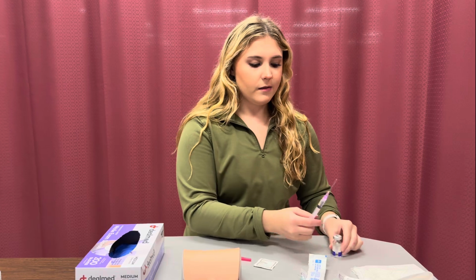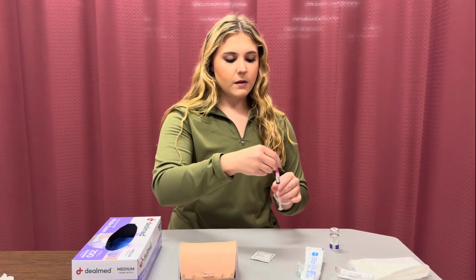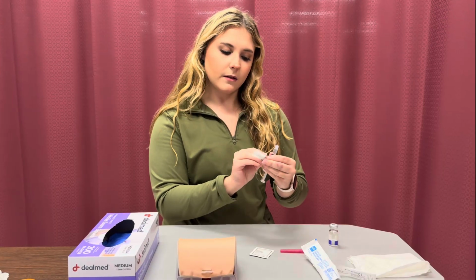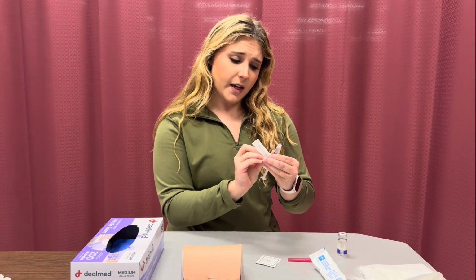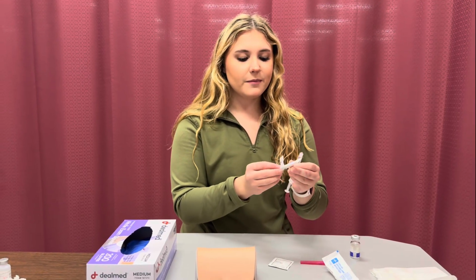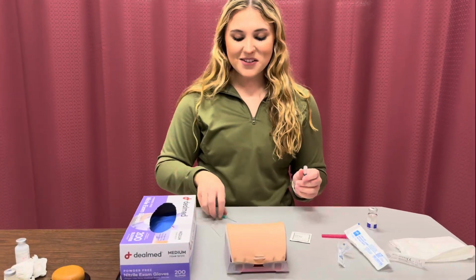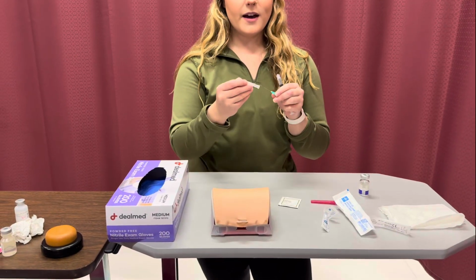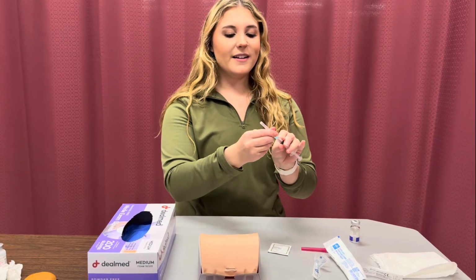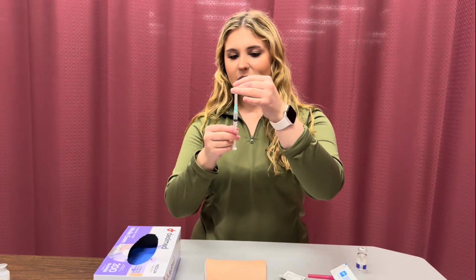There we go. Go ahead and recap this. And then I will switch it out for my, I believe this is a, let's see, 20 gauge. Oh my goodness. It came out. It's okay. Mine does not do that, my little orange one. Okay, so normally that would not happen, but you would apply it here. It's fighting me. You would apply it, you would clean off the area on the patient. You would take, this just does not want to stay on there.